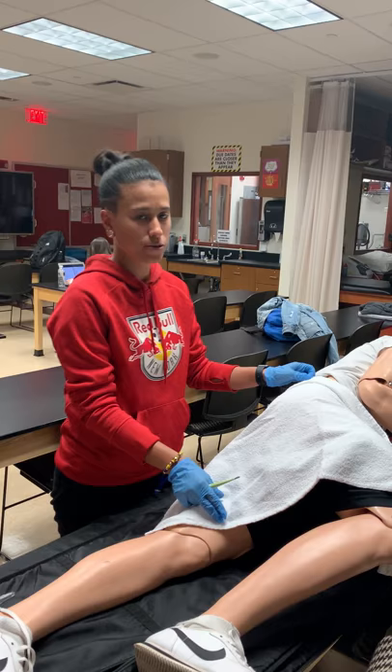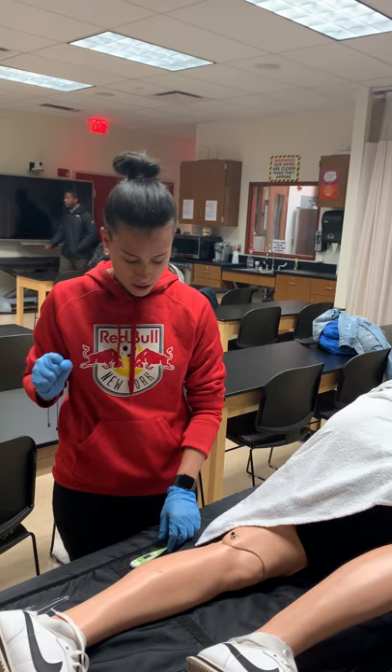First, I have the patient laying in a recovery position, making sure that he's comfortable with a towel draped over for privacy.